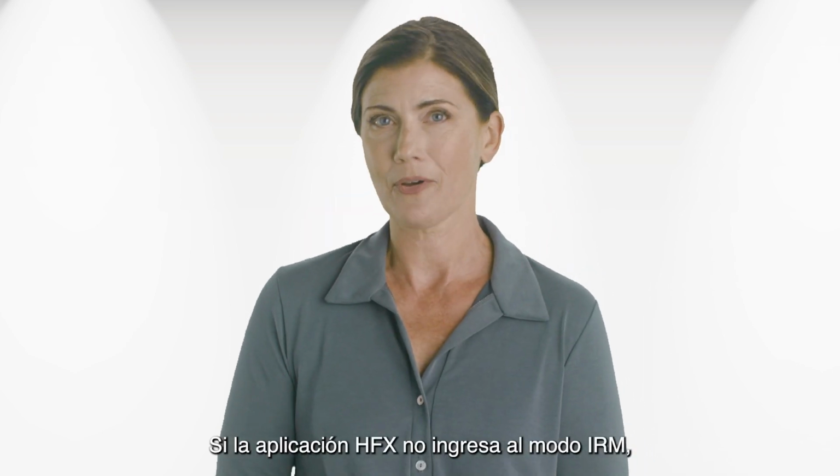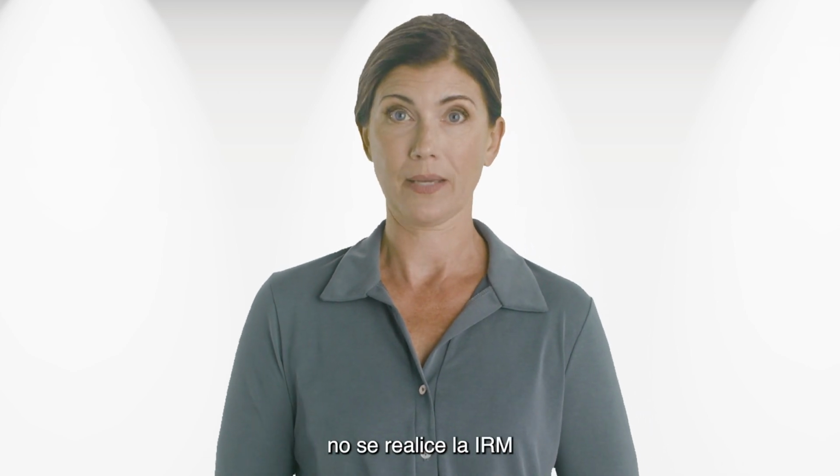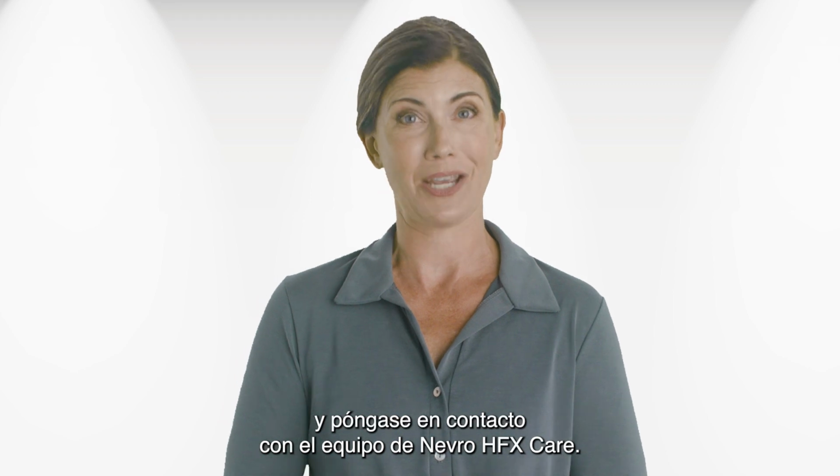If the HFX app fails to enter MRI mode, don't proceed with the MRI and please contact Nevro HFX Care Team.